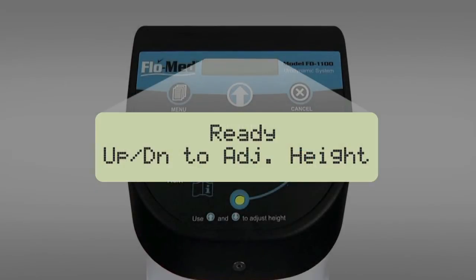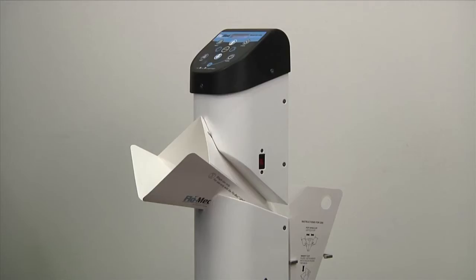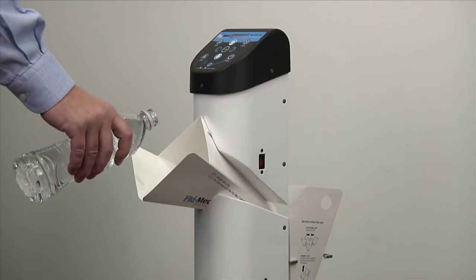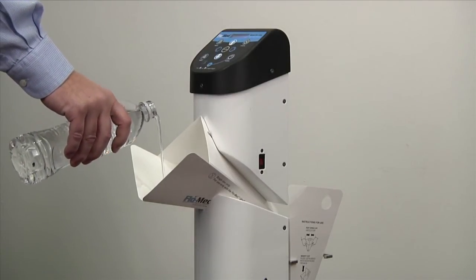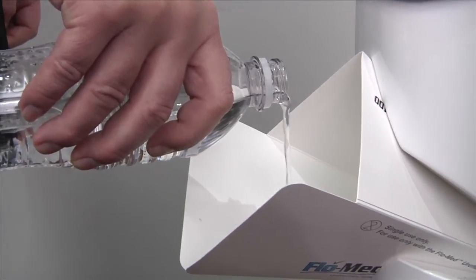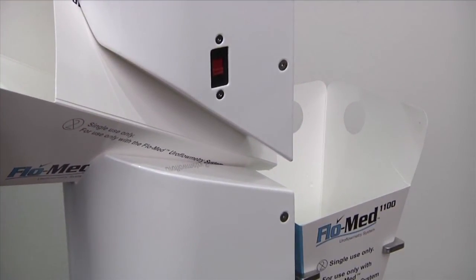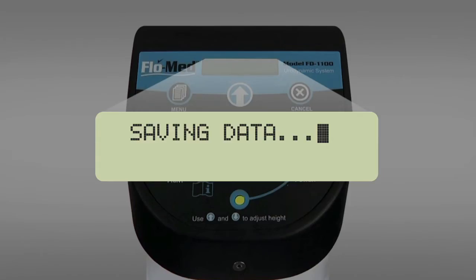Set the funnel to the appropriate height by pressing the up or down button on the keypad. This can be accomplished by the doctor, clinician, or patient. Request the patient to void into the funnel — as shown using a water bottle in this demonstration — and try to maintain the stream direction on a specific area.